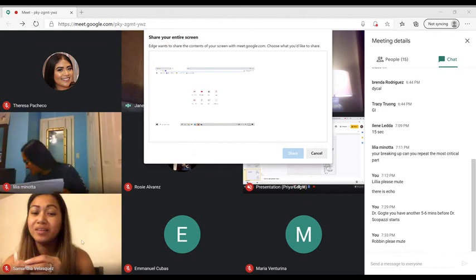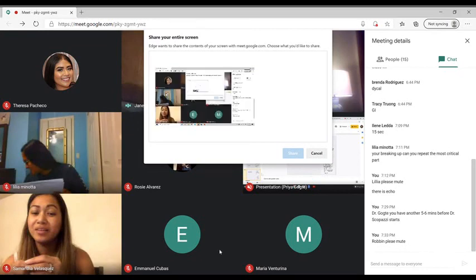With that said, we need to review it. We've already learned how to pack the amalgam. We know that in an amalgam preparation, there are undercuts that we need to pack and address.